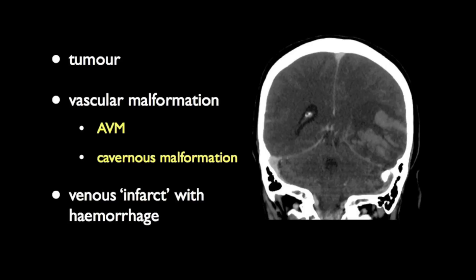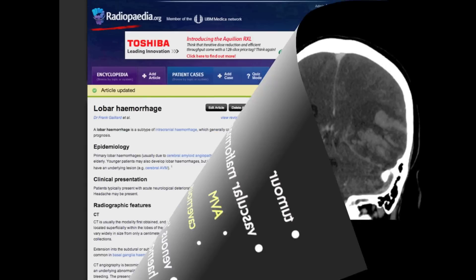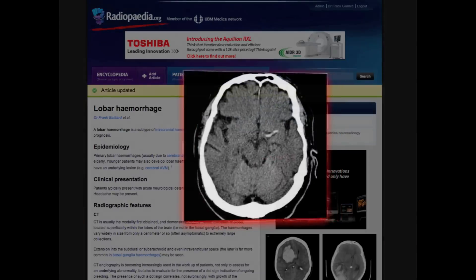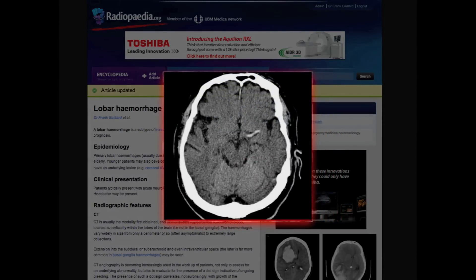In this case, the sigmoid sinuses can be seen containing a filling defect. You can read more about lobar hemorrhages and other forms of intracranial hemorrhage on Radiopaedia.org. In our next episode, we will be covering hyperacute signs of ischemic infarction on CT. See you then.